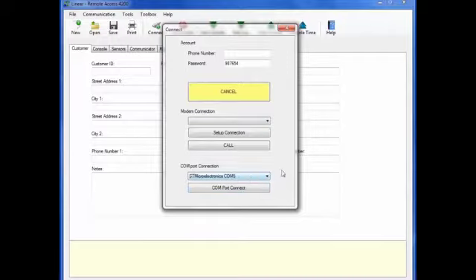First, close out of the RA4200 program software. Disconnect the USB to mini cable from the computer or laptop. Then reconnect. Recycle power to the PERS-4200 unit. Click on the RA4200 program software on your desktop and try again.